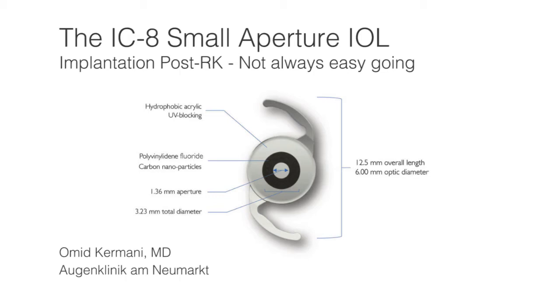The implantation of an IC8 small aperture IOL in a post-RK eye has advantages regarding the reduction of optical aberrations. At the same time, the small aperture increases the depth of focus and improves intermediate and near vision. The implantation, however, can be complicated by some traps I would like to reveal in this video for fellow surgeons.